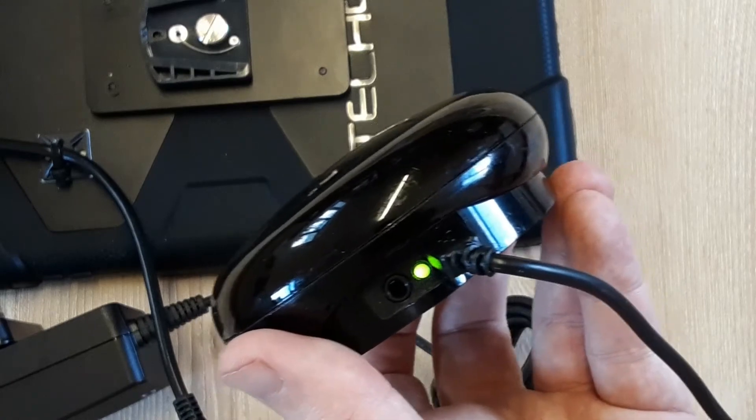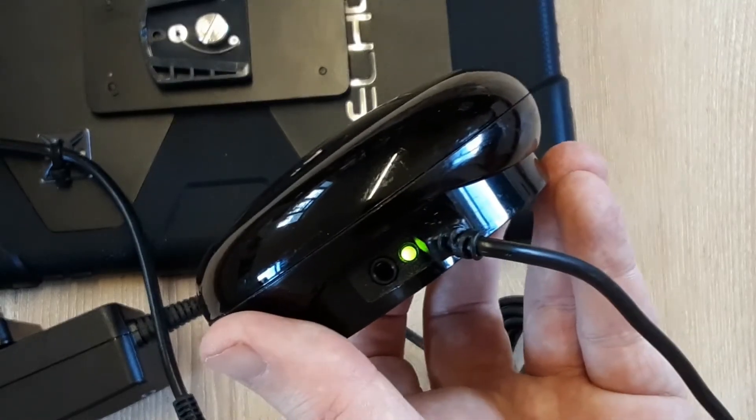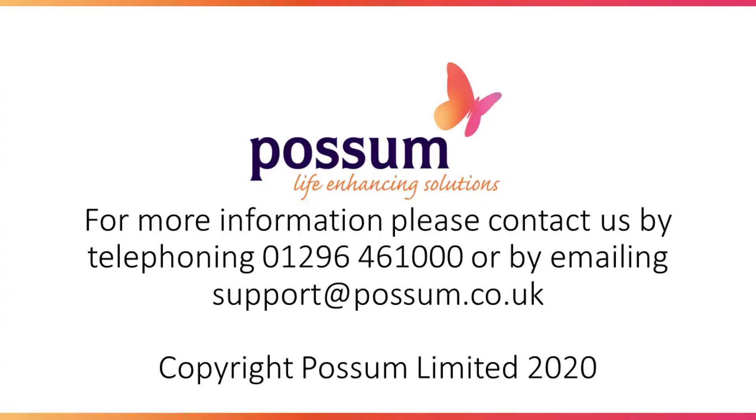When the device is fully charged, the light will go green as shown.